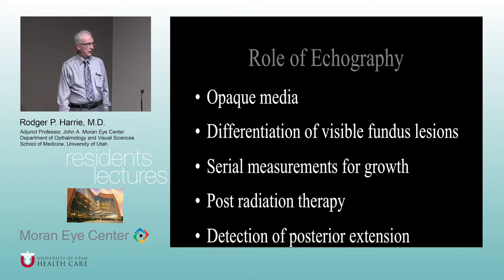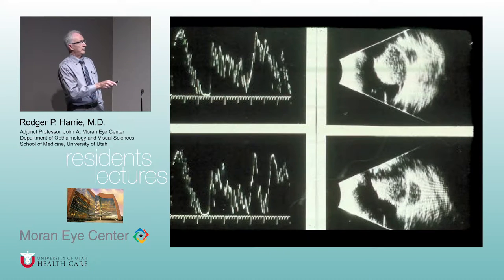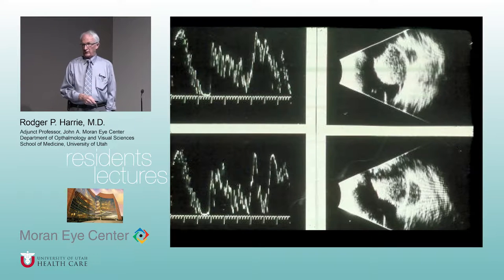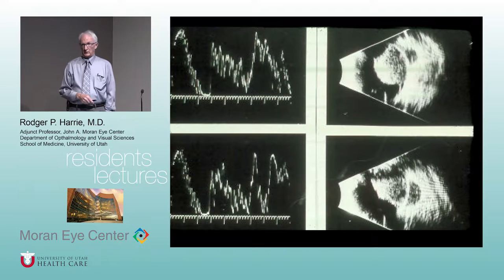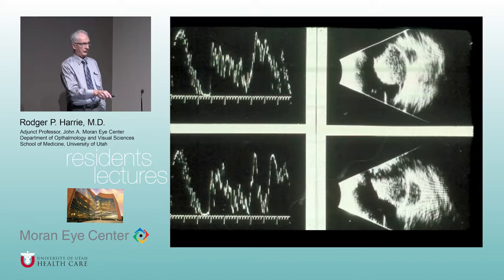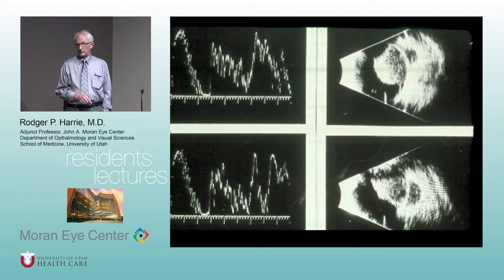Posterior extension. Here's a large melanoma tumor, and this is a B-scan. That little density in the orbit is a posterior nodule - it's broken through the sclera and is actually in the orbit. That changes the situation entirely. Especially if you want to enucleate these, you have to be really careful. If that's encapsulated, you're probably okay. But if it's not, you get into the orbit and you're talking exenteration, which is a really horrendous procedure.